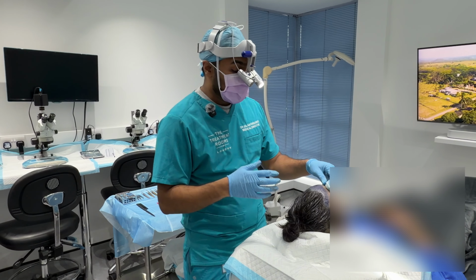Now we find that actually with the dull implanter, so not quite having a sharp needle, but a dull needle, we're allowed to utilize our pre-made incisions that we did in the morning. And actually what's quite nice about that as well is because it's dull, it kind of follows the channel of those incisions in a really nice, natural way.